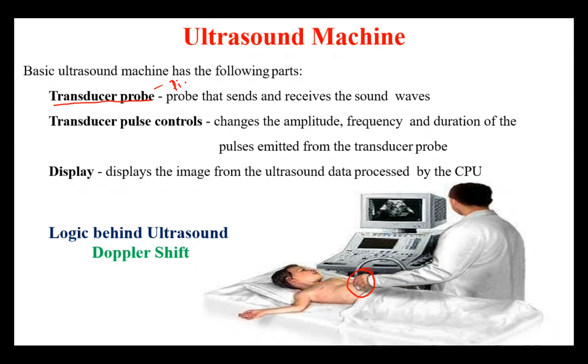Piezoelectric crystal, is that correct? Yes. It is made up of quartz material. So we'll discuss piezoelectric crystal in detail in sensors and measurements, and we'll solve some problems with it. The piezoelectric crystal is a material incorporated inside the transducer.